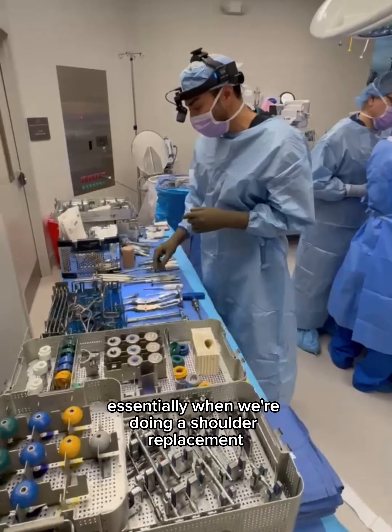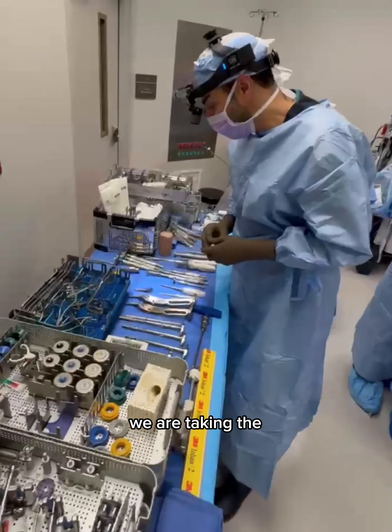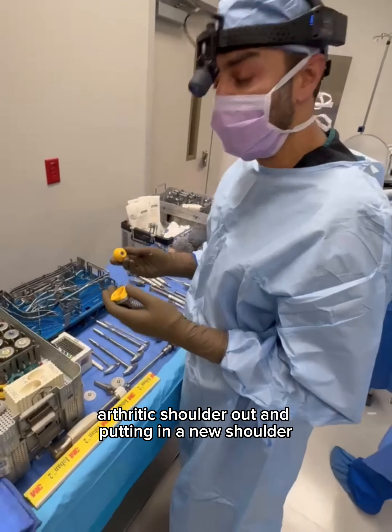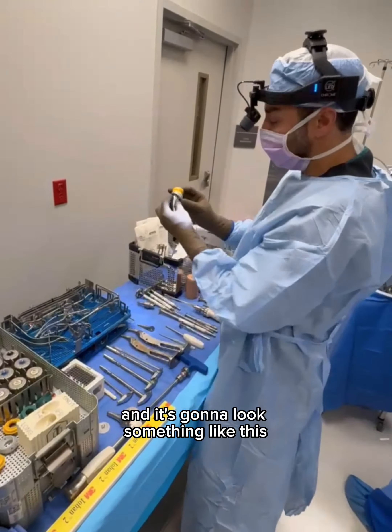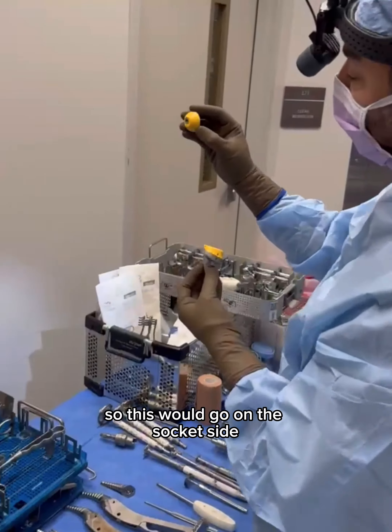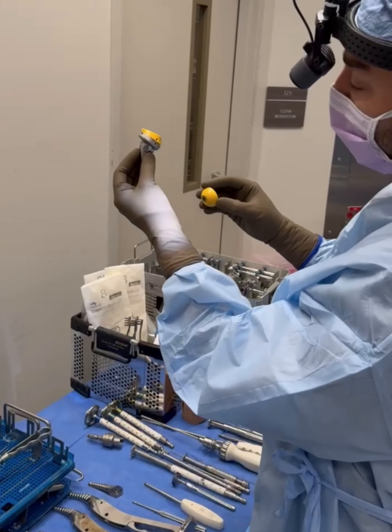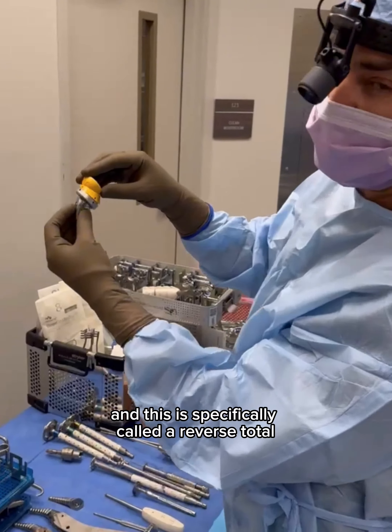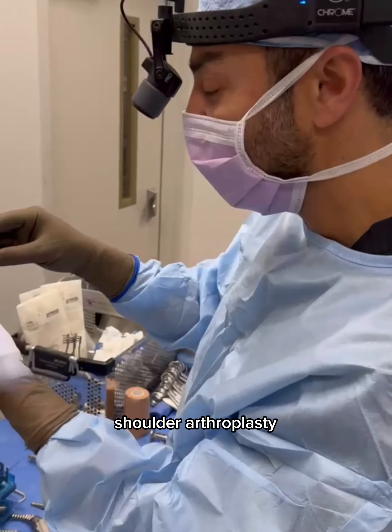Essentially, when we're doing a shoulder replacement, we are taking the arthritic shoulder out and putting in a new shoulder, and it's going to look something like this. This would go on the socket side, this would go on the humerus side — so it articulates like this — and this is specifically called a reverse total shoulder arthroplasty.